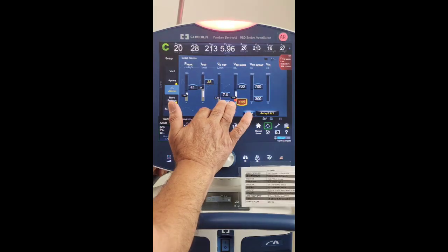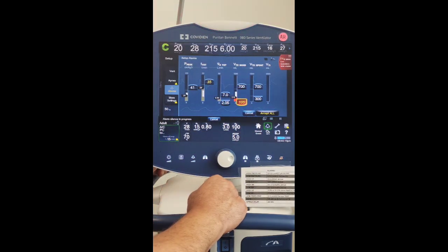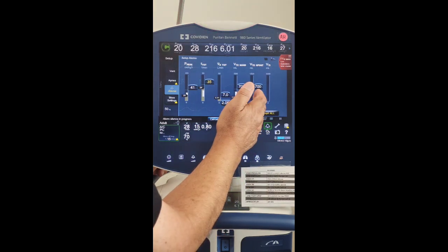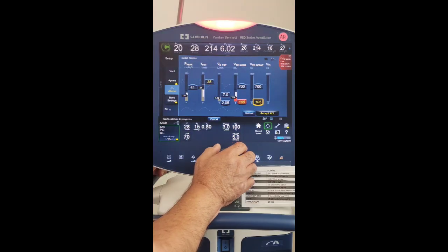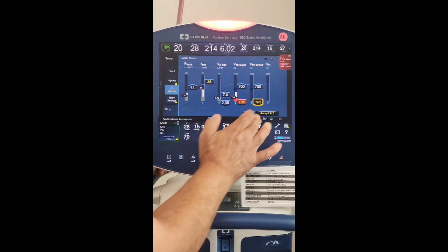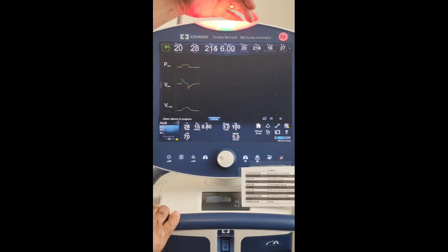At least we have an alarm in case it drops. And now we also have spontaneous breaths. If the patient is going to breathe spontaneously, we would want to adjust this one as well. Let's just go down to 105, keep that the same. Okay, alarms are set, accept, and then up here you had a red bar blinking. Now it's green, indicating that we've corrected the problem. I'm going to reset it.